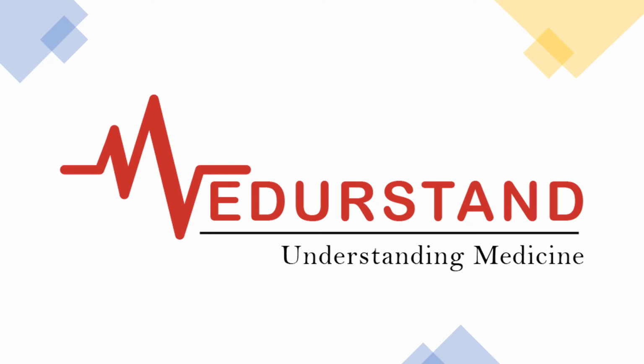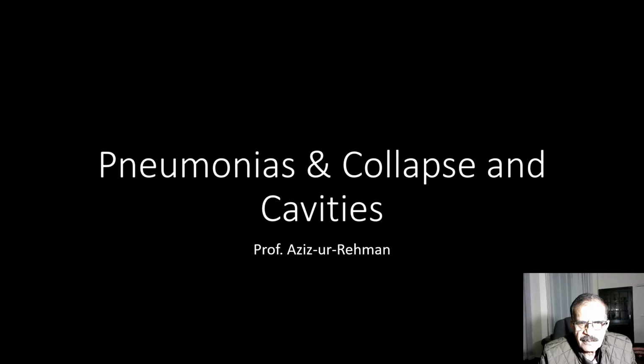Understanding Medicine. I am Professor Aziz-ur-Rehman, and we are discussing various radiological abnormalities. I have already discussed a normal X-ray chest, and then we had a full lecture on pleural effusions, and then we also had a lecture on COPD and pneumothorax. So this is the next in the series, and today we're going to cover pneumonias, collapse, and cavities in the lungs.